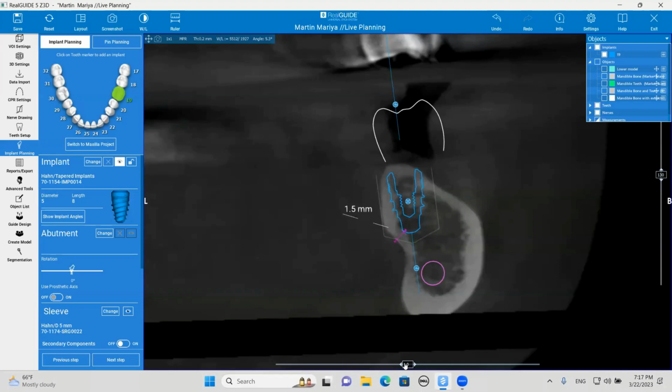One option would be to build up the bone a little bit with guided bone regeneration and build up the ridge. Do a ridge augmentation as phase 1, then come back and place the implant in phase 2. The second option would be to place this implant, and at the time of placement, I always prefer to take some of the bone from the actual surgical burr and pack that buccal plate, just where he's showing you right here.